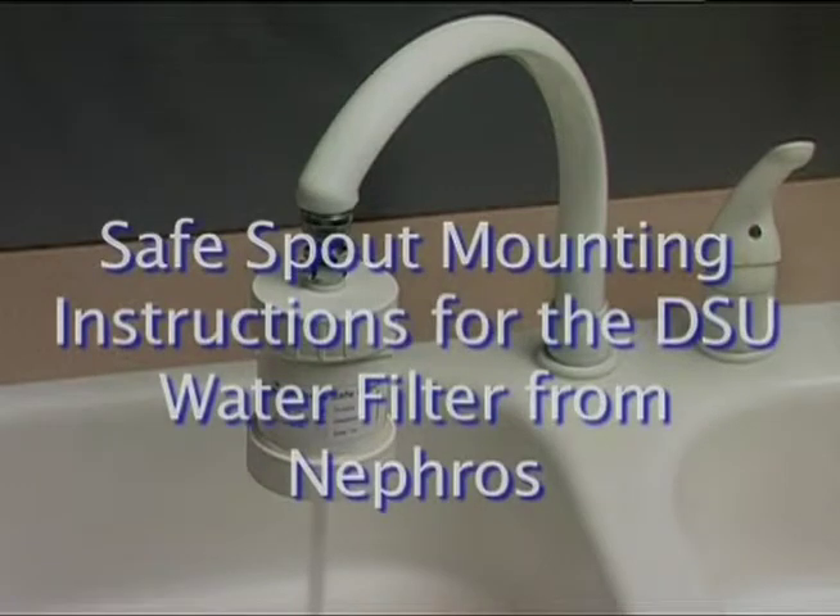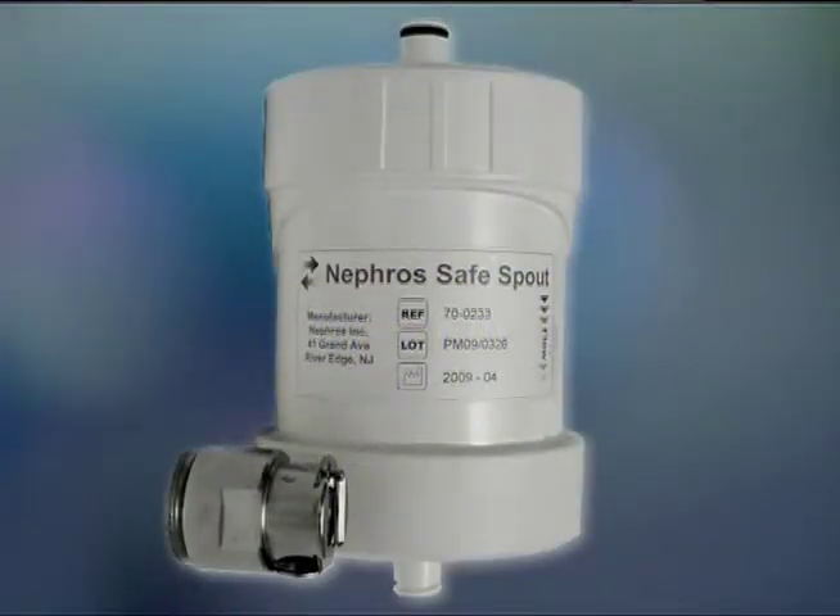Mounting instructions for the SafeSpout water filter from Nefros. You will need a SafeSpout water filter and a female quick connector for the installation.